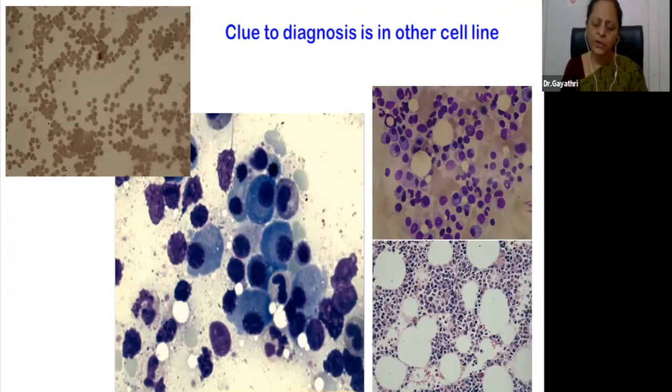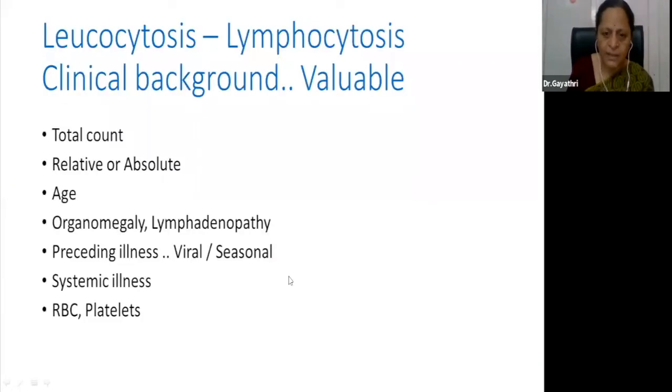You can train your eyes to also count plasma cells and blasts also in the trephine core. You must have access to good sections, well cut and well stained, and then you can identify the individual plasma cells and count them. But I would rely more on well stained cytology. So if there is leukocytosis or there is leukopenia, if there is red cell abnormality, you would look at the marrow and be rewarded with something that could be diagnostic.